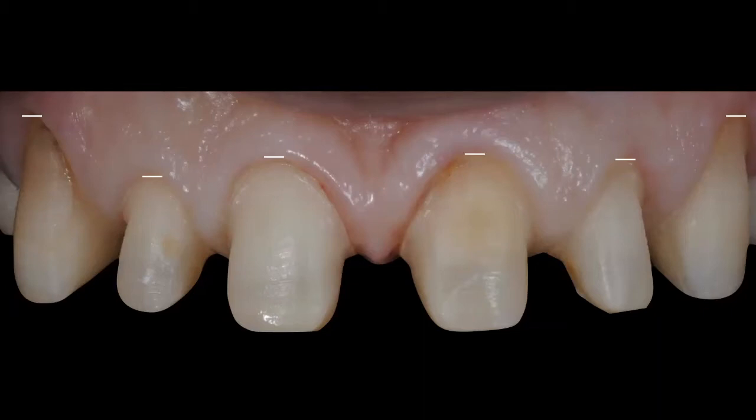So those are the things that can complicate a full mouth case. And again, I'll share with you a couple of tips and tricks for single dark teeth on how we go about working on these teeth, and you can use those same techniques for your larger cases. But if you choose the right substrate, and if you're doing all your restorations in one shot, this most likely is not a big issue.